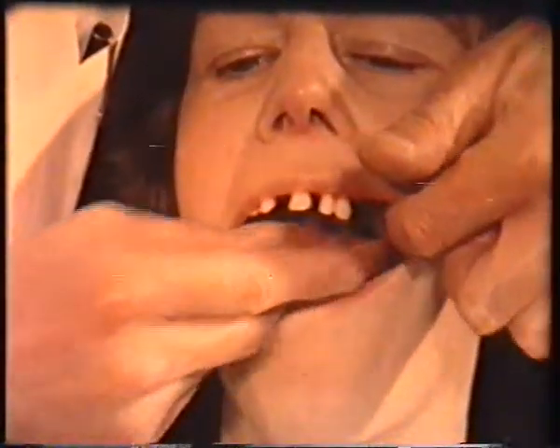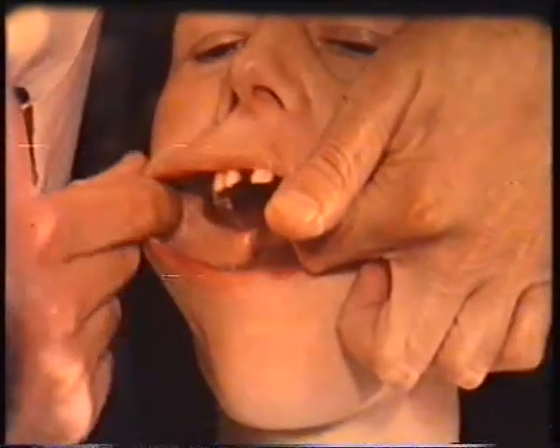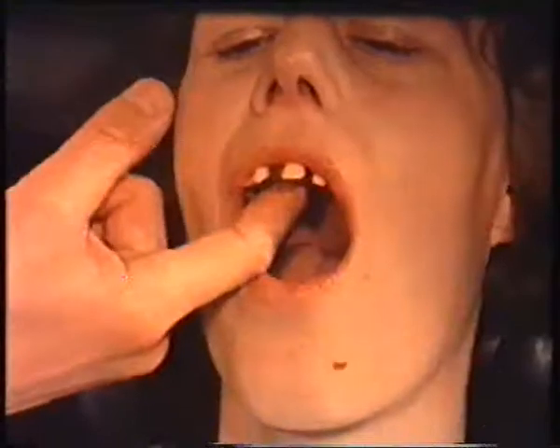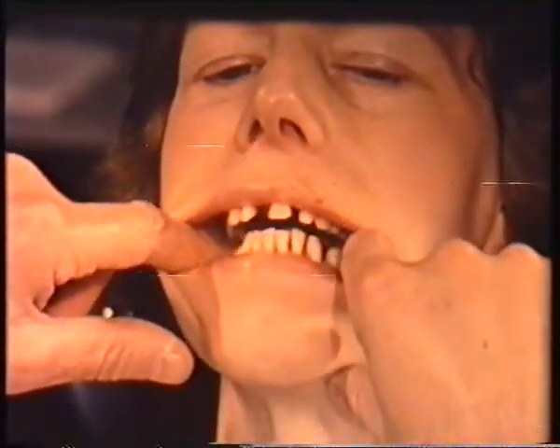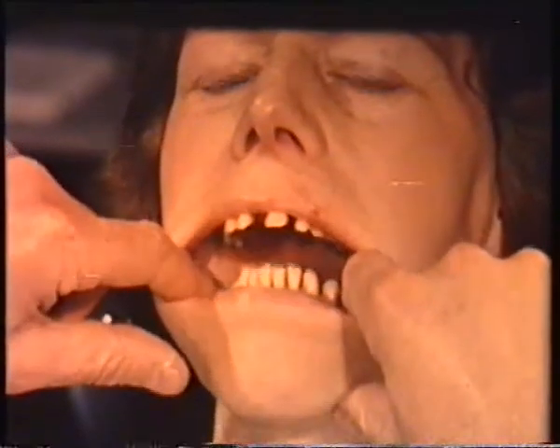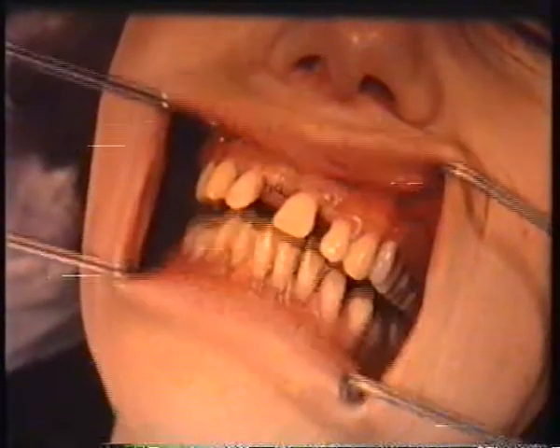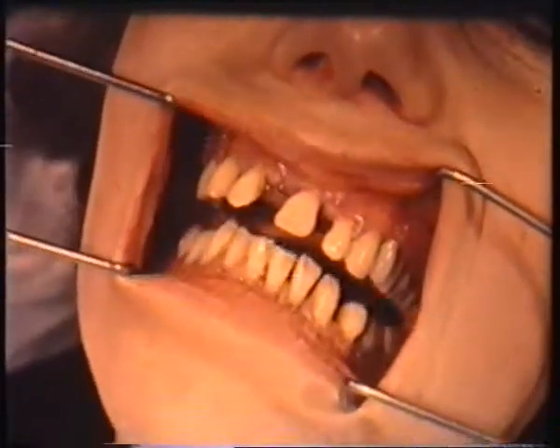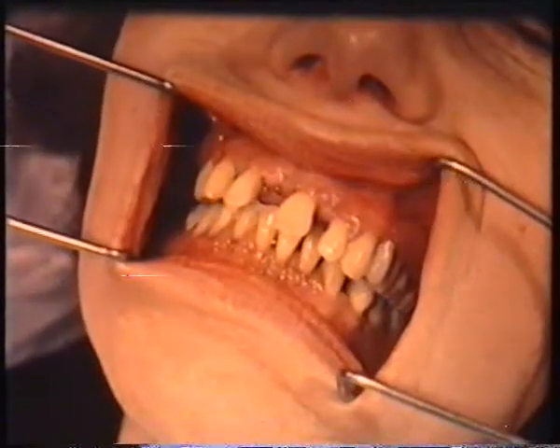At the next visit of the patient, the partial wax dentures are tried in the mouth to check the recording of the occlusal relationship, the shade of the teeth, and the position of the teeth in relation to the surrounding musculature. In order to compensate for the small degree of reduction in vertical face height that has followed the loss of the posterior teeth, a small increase in the vertical dimension of the occlusion has been made.